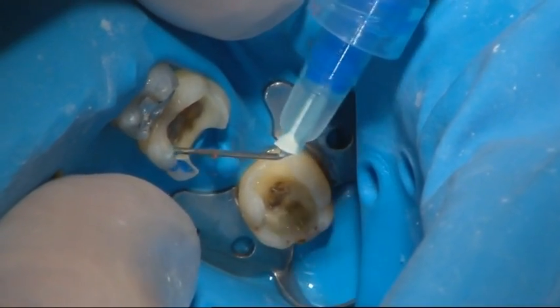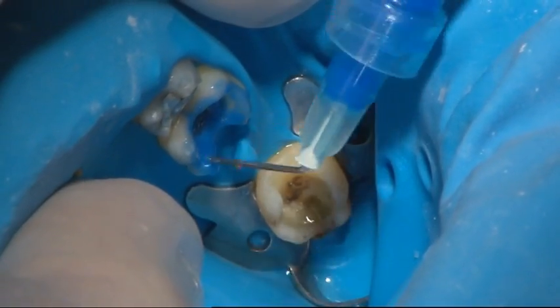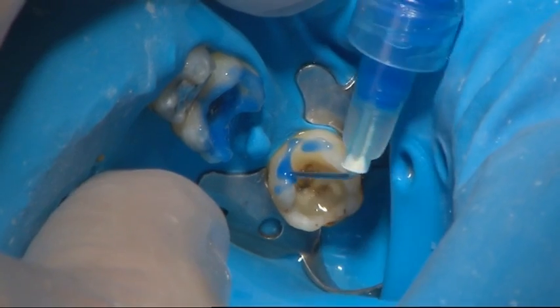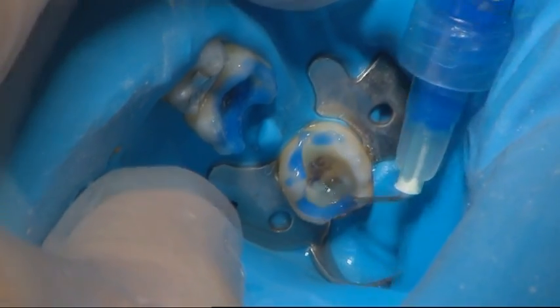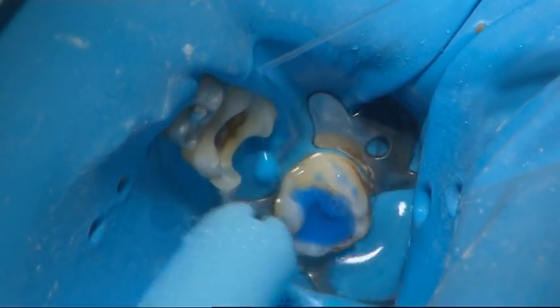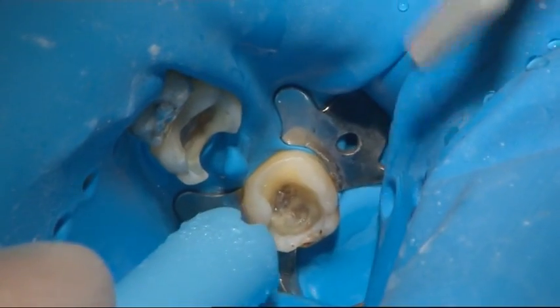The surfaces of the teeth were etched with orthophosphoric acid, according to the bonding agent manufacturer's instructions. The teeth surfaces were then rinsed with water and air dried carefully after etching.